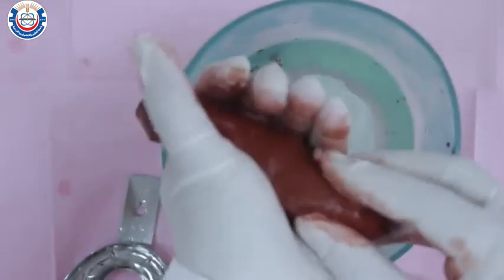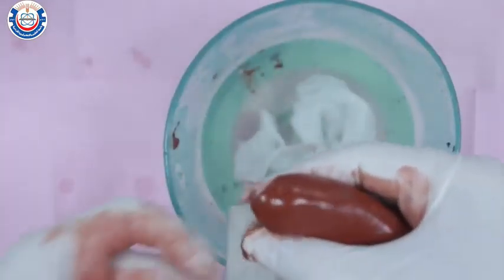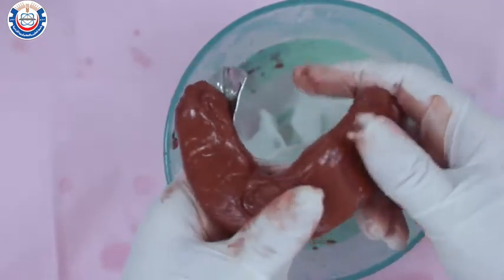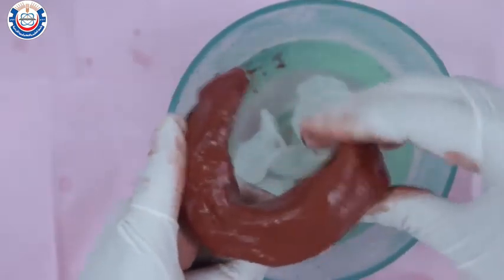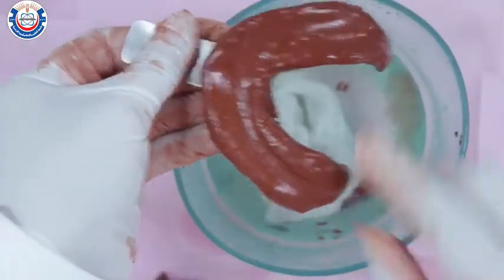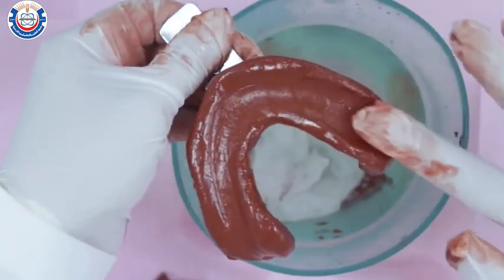Once the material is completely softened, roll it between your palms and slowly start loading the tray. Load the tray from one end to the other gently to avoid incorporating air bubbles or creasing of the impression surface. Make indents on the surface of the impression to accommodate the shape of the arch, making sure that all excess material is directed towards the lingual surface.